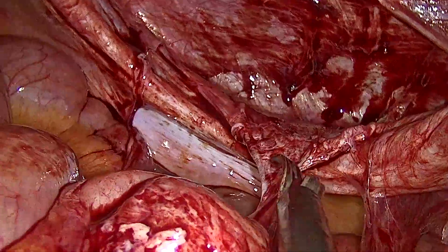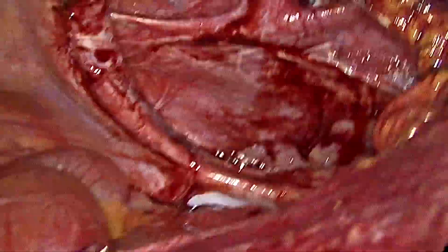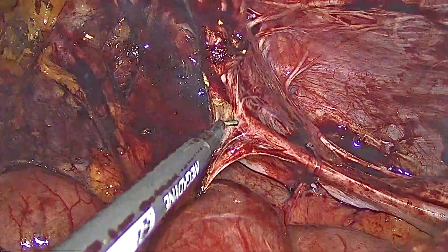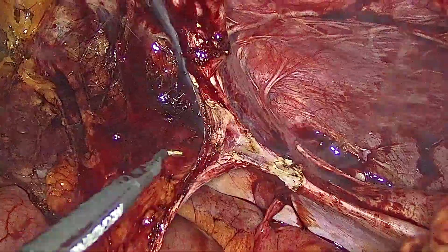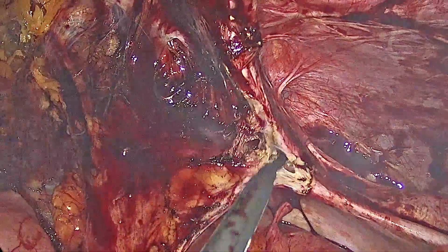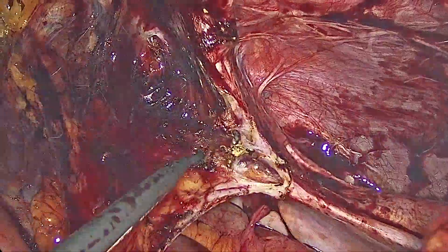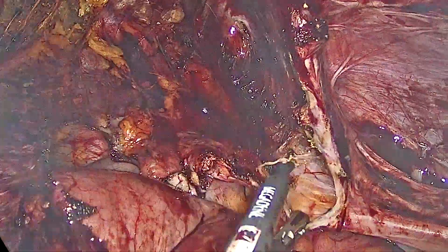After adhesions are released, dissection of the peritoneum continues on the opposite side, dividing the posterior border of the defect and extending posteriorly and laterally well into the retroperitoneal space. This allows recruitment of sufficient peritoneum for primary closure of the peritoneal defect and ensures adequate posterior extension of the mesh.